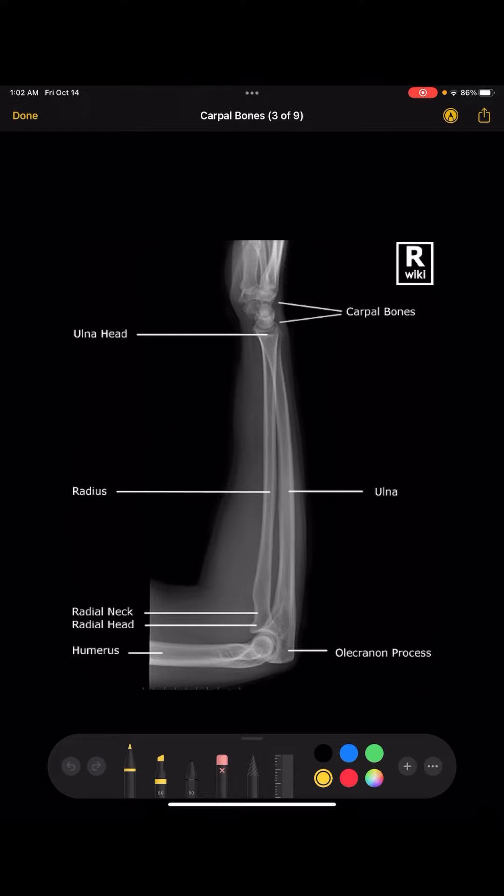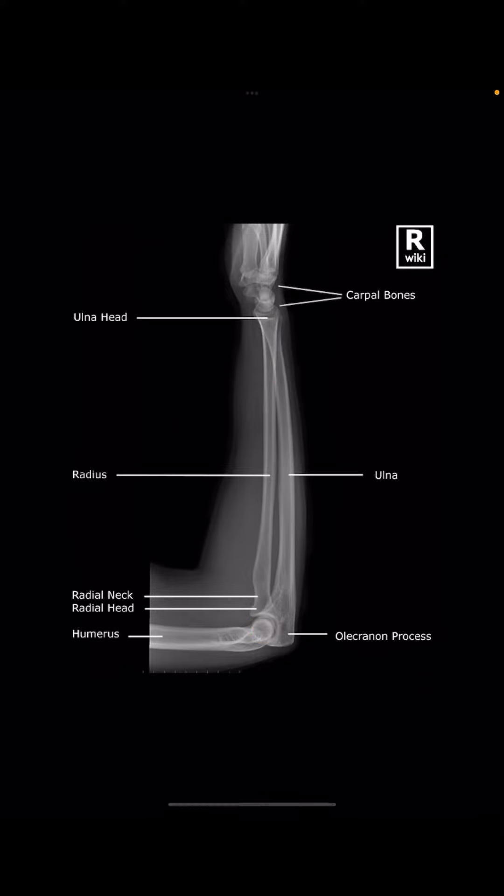For the lateral view of the forearm, you need to make sure that the radius and the ulna are nicely superimposed. The humeral condyles should be nice and circular — when I'm talking about the condyles of the humerus, I'm talking about the capitulum and the trochlea being superimposed over each other. When they're superimposed, it'll look like a nice little circle.